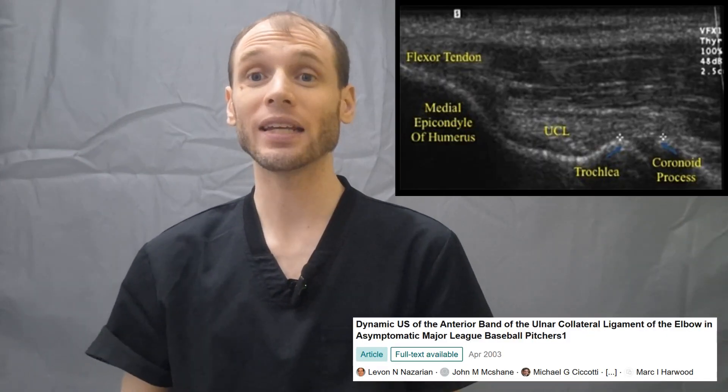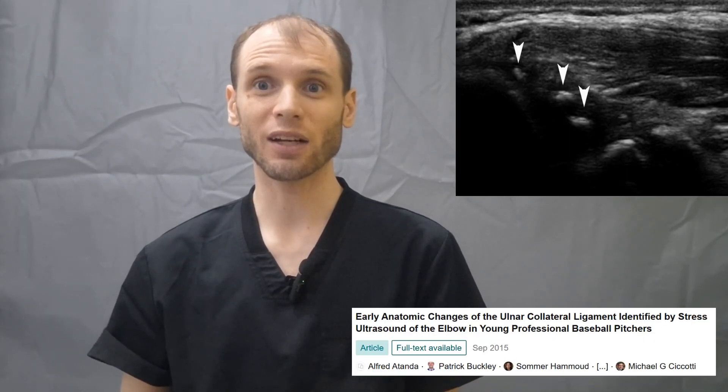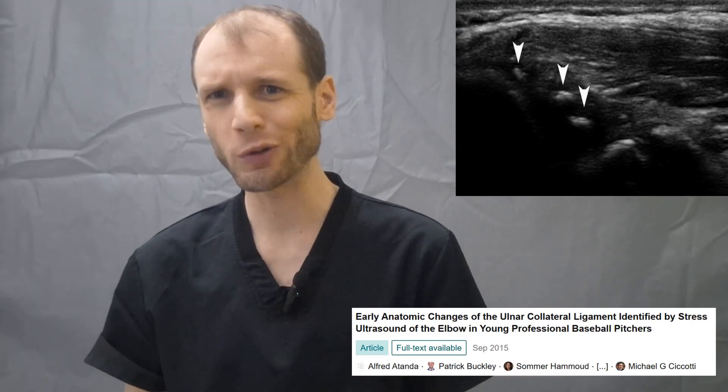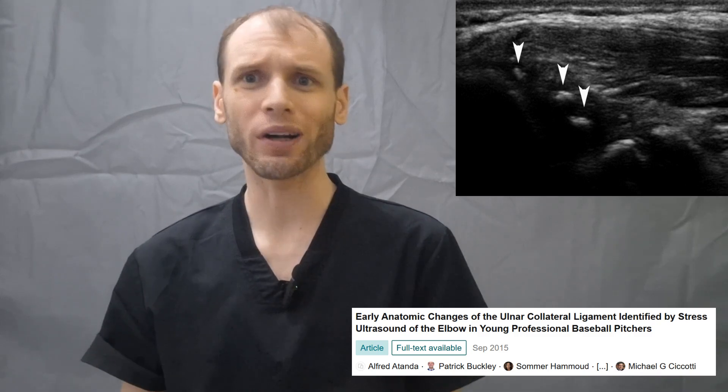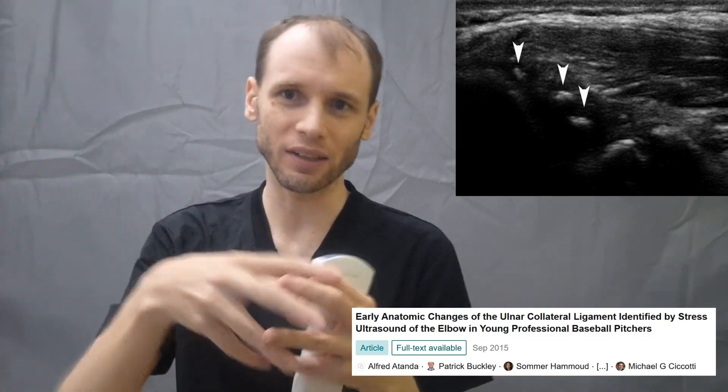In fact, if you scan an asymptomatic picture you may find that the ligament itself looks sort of all torn up and chewed up, and the bone cortex looks all chewed up because it's been torn and healed again and again. Such a common injury with throwing.